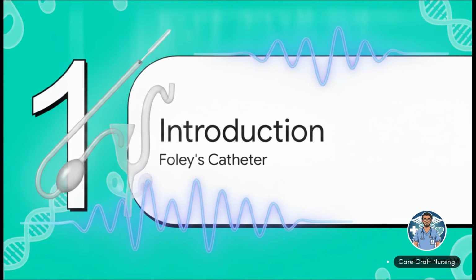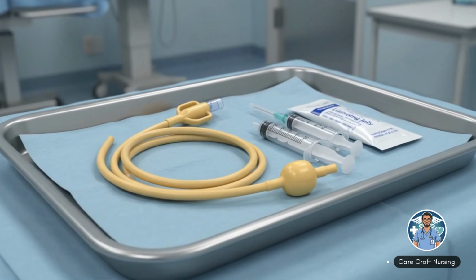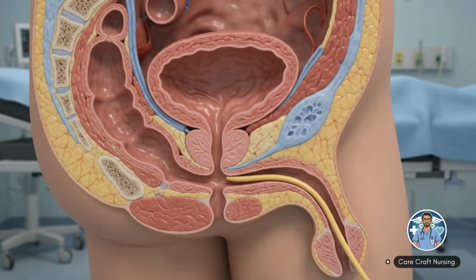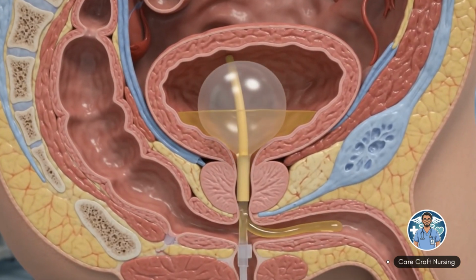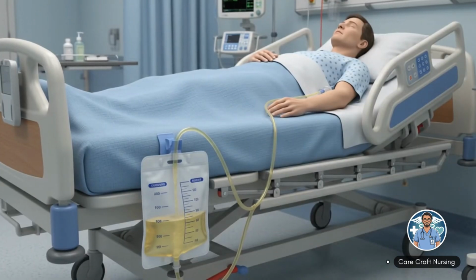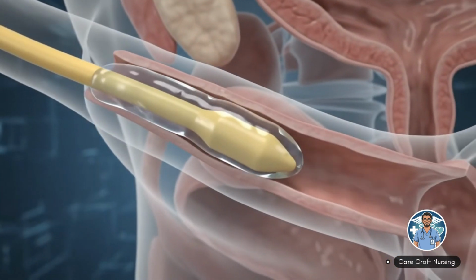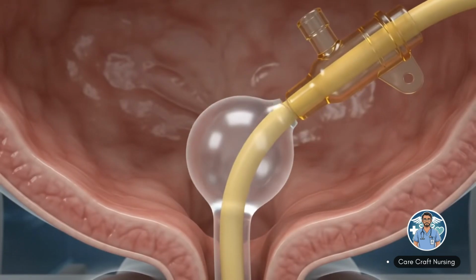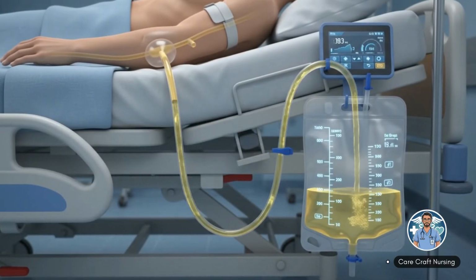Part 1. Introduction to Foley's catheter. So what exactly is it? Well, notice the heavy emphasis on the word sterile. A Foley catheterization is fundamentally a strictly sterile medical procedure. You're carefully guiding a flexible tube right through the urethra and directly into the urinary bladder. Why? Mostly for reliable, continuous urine drainage. Now, I know it sounds pretty simple, but maintaining that sterile field, it's literally everything. You're dealing with a direct, open pathway straight to the patient's kidneys, so we really can't mess around here.